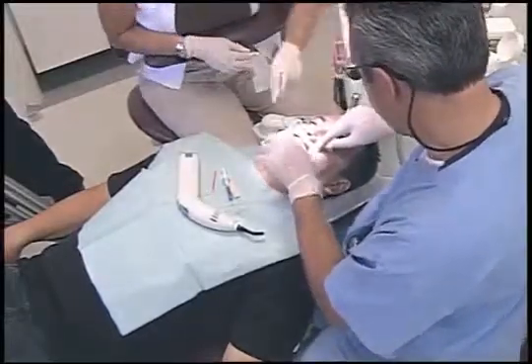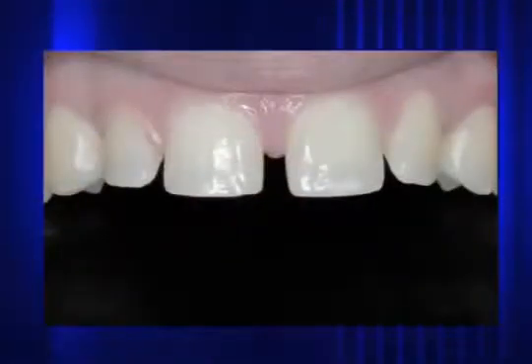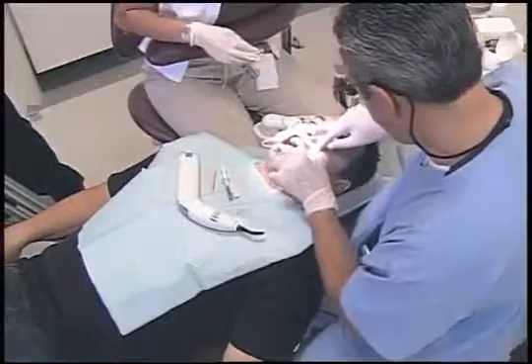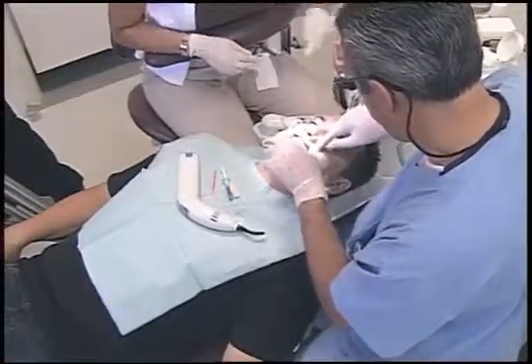Today I want to share with you a patient we treated recently. His name is Chris. He's going to be a no-prep veneer case using Vivaneers. You can see the spaces that he's got between his teeth. He's a great additive type case, so this is going to be a good chance for us to really make an overnight improvement. Not even overnight. I mean, by the time we try in the veneers, he's going to get a chance to see what he looks like without any spaces in there.